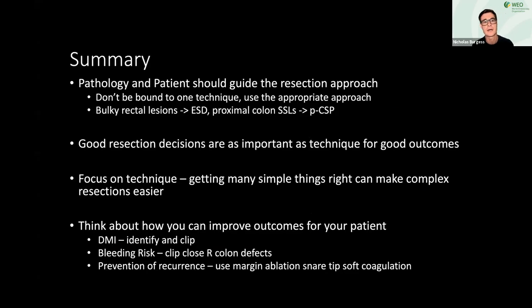And in summary, I just wanted to say that pathology and the patient should guide the resection approach. Make sure you appraise each lesion. And as has been shown in the talks previously, choose the appropriate technique for the appropriate polyp that's in front of you. Bulky rectal lesions, really, they should be done by ESD, I think now. Proximal colon sessile serrated lesions should be done by piecemeal cold snare polypectomy.